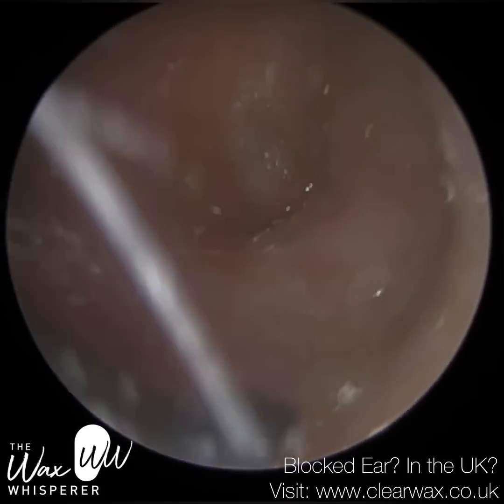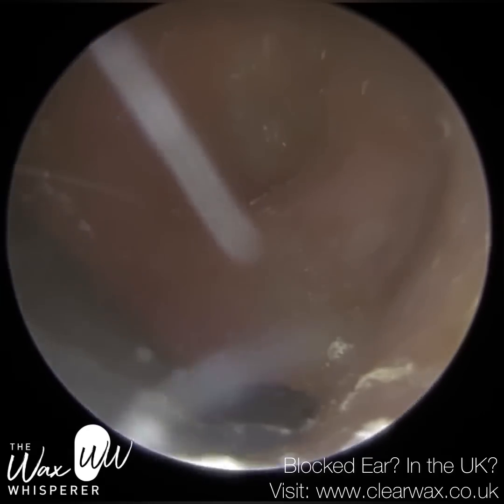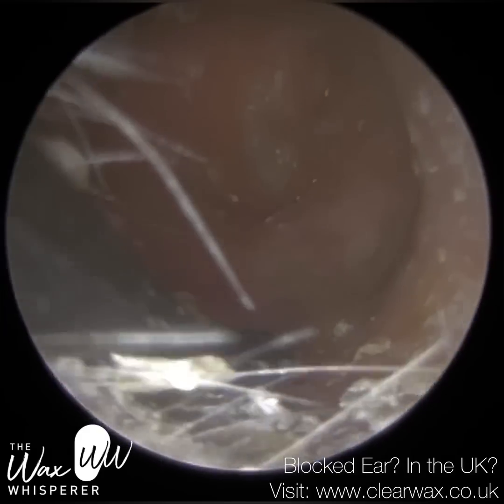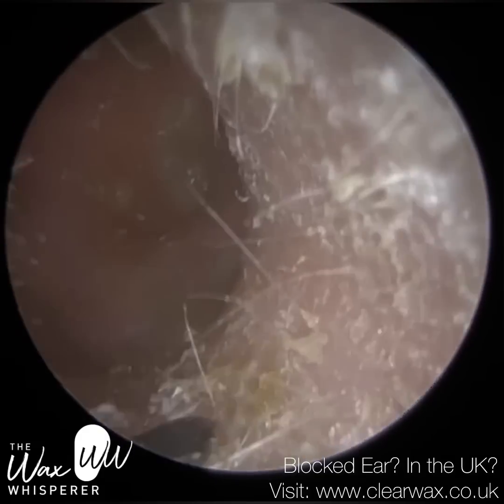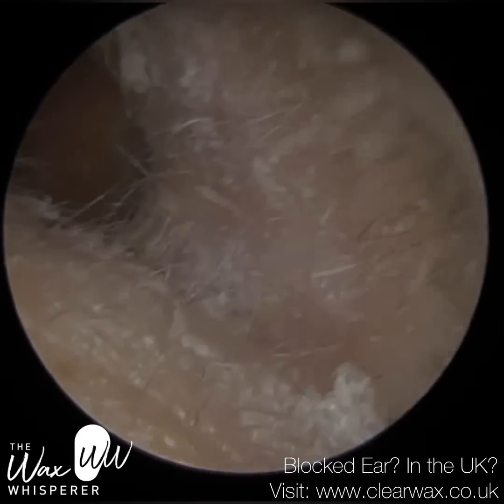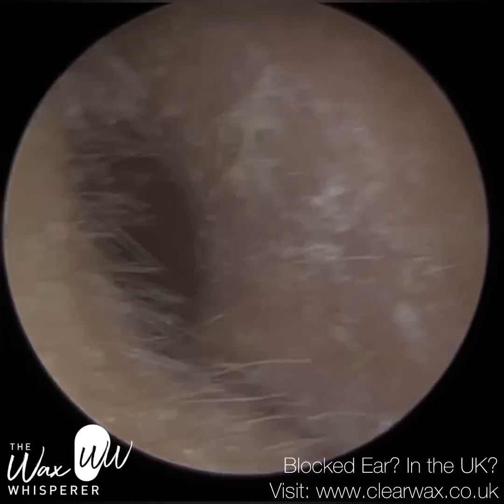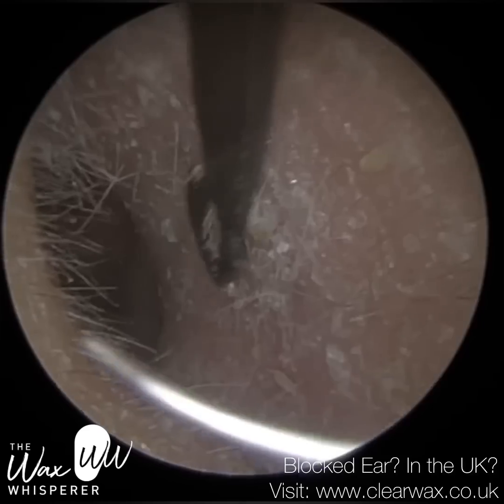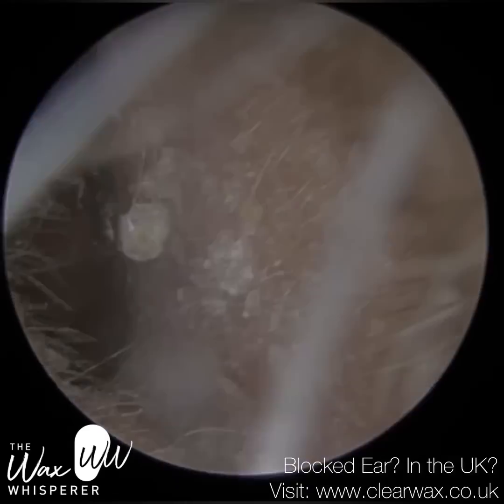So I'm just, with the Curette now, I'm coming backwards, because with the design of the Curette, it can also start separating skin if you go in the reverse. Not as effective as when you go forwards, but that tip is, as I said, tapered, and with the opening, the hole, the inside, you can see it already there. It can go underneath.